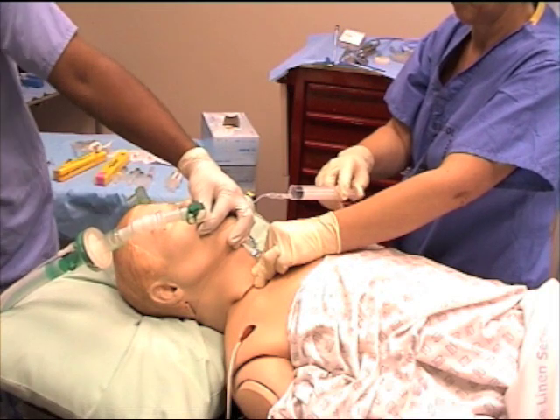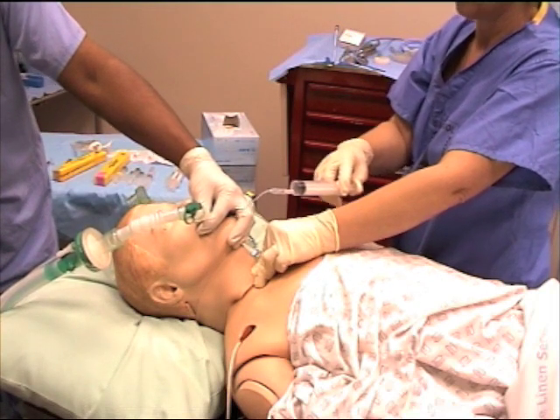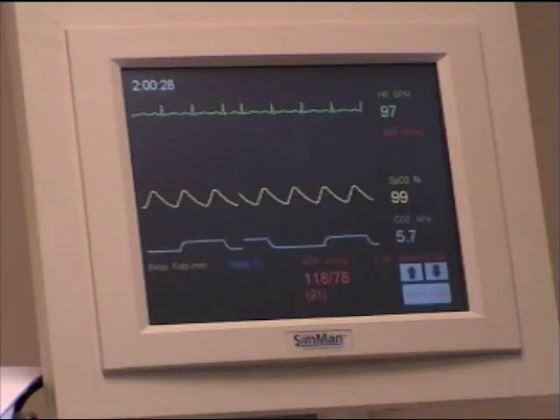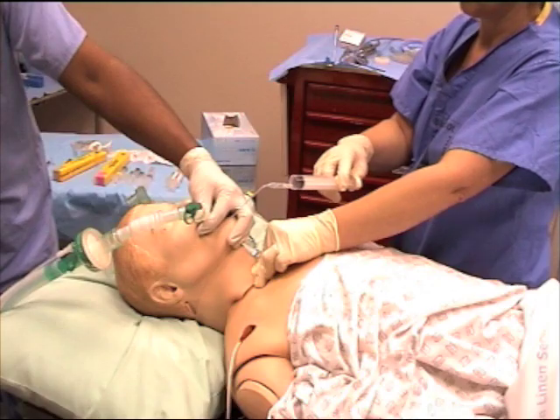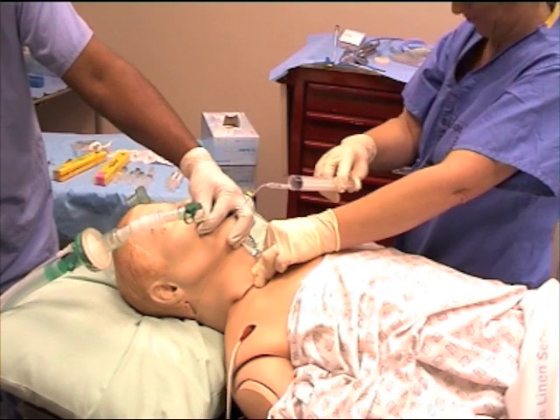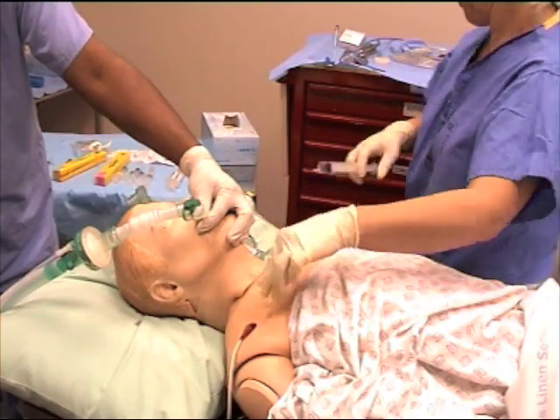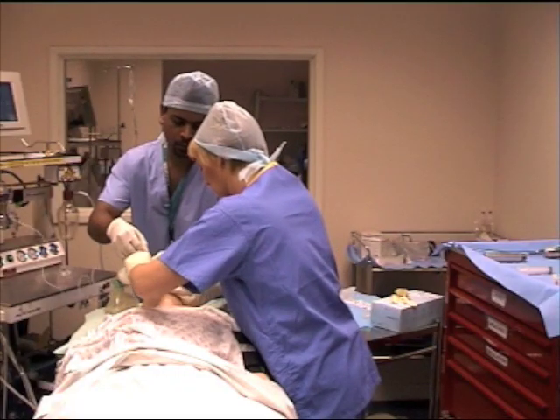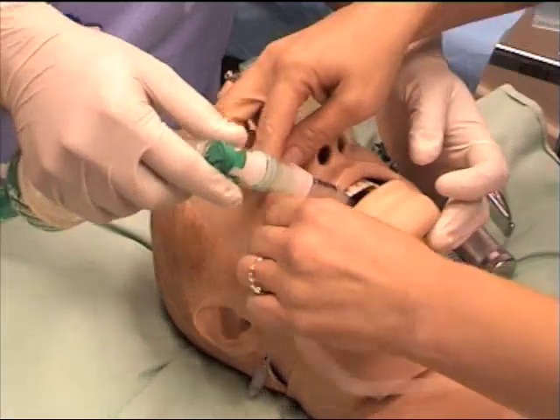Once intubated, confirm its placement by observing end-tidal carbon dioxide and also by listening to the chest at both axilla. Cricoid pressure can be released at this point only after a verbal request from the anesthetist. Secure the endotracheal tube according to local practice.